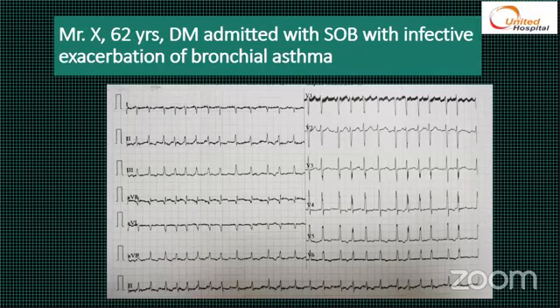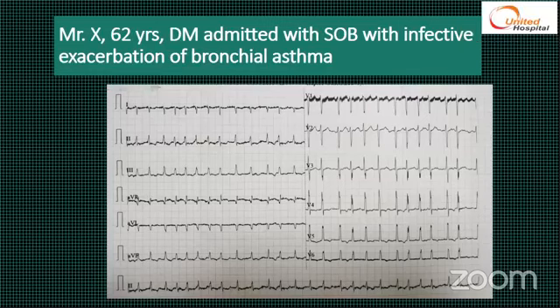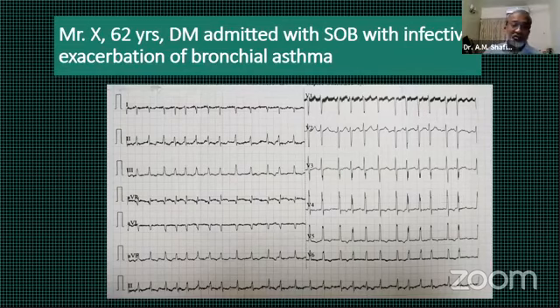Sir, less likely, as in V1, V2, V3, the R wave is not positive in the front chest leads, and there is not a progressive decrease in the height of the R wave in the chest leads, sir. I don't think it is a case of dextrocardia. So it is a misplacement of the lead, sir, a possibility. That is a technical dextrocardia.